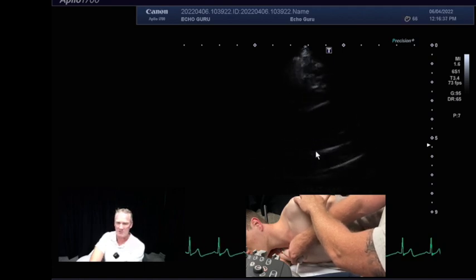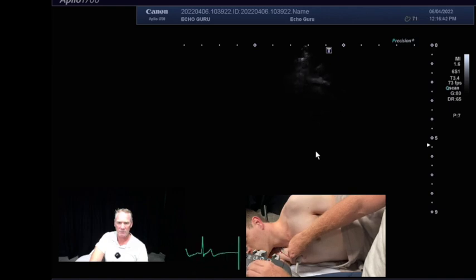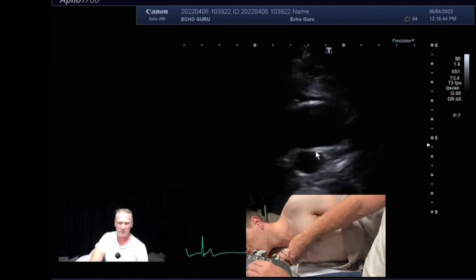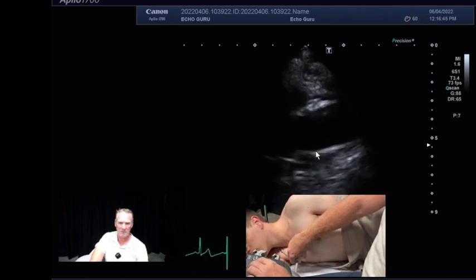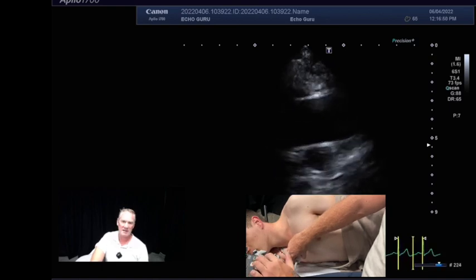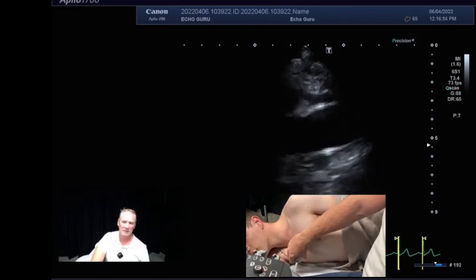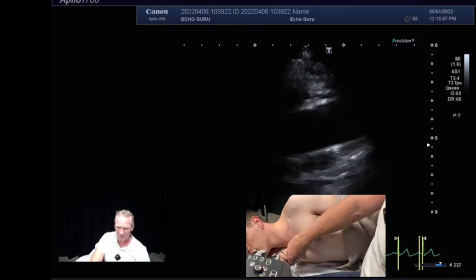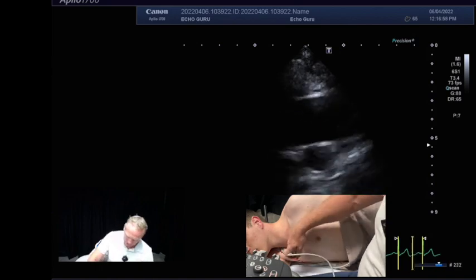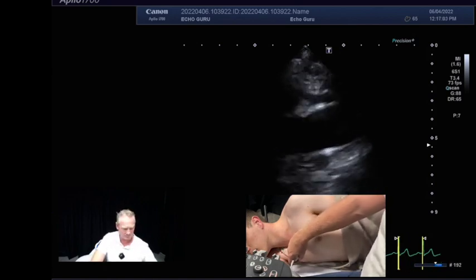Breathe away, and I'll get you to do that again. Breathe in for me, then breathe all the way out. Perfect, breathe away. And you can see how much of an impact breathing has on that image. So very happy with that. Just breathe normally there. And you can see that's going to be a perfect spot then for me to use my PEDOF probe.